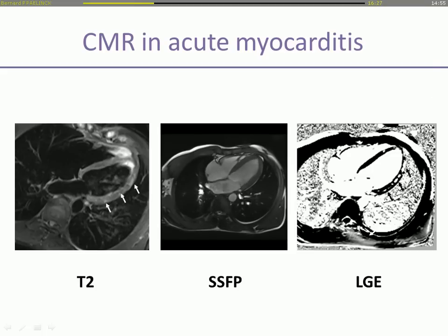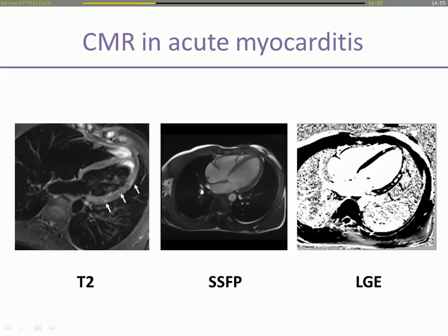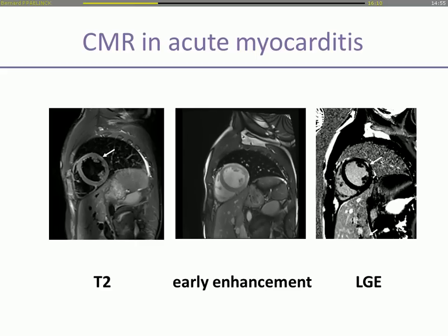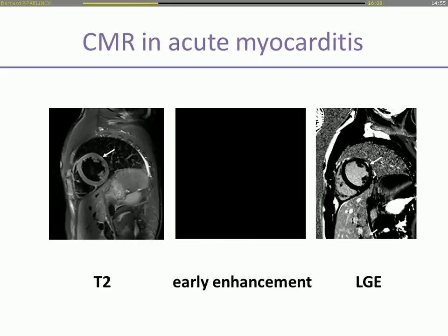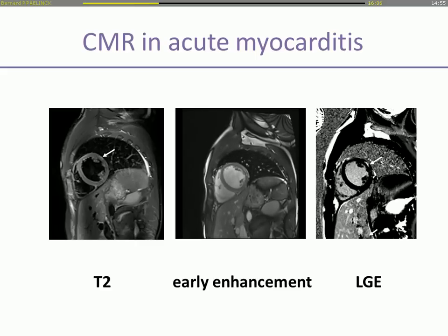The same can be seen using late gadolinium enhancement, with those islands of high signal intensity in the mid-wall and in the sub-epicardium. These are the corresponding short-axis images at mid-ventricular level. Again, early enhancement and late enhancement, typically in the mid-wall.